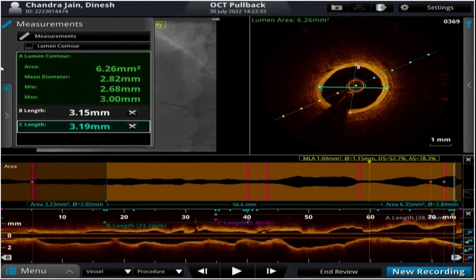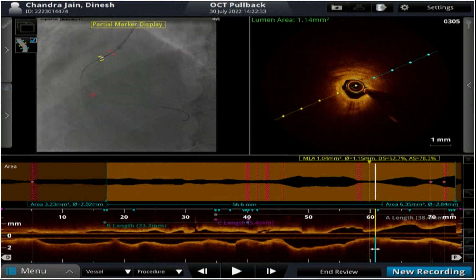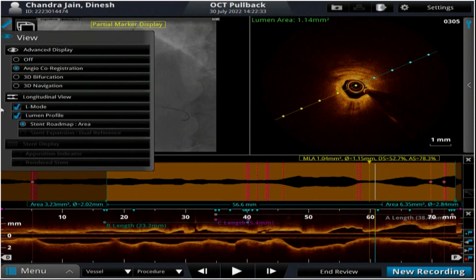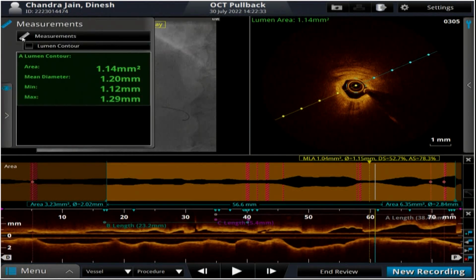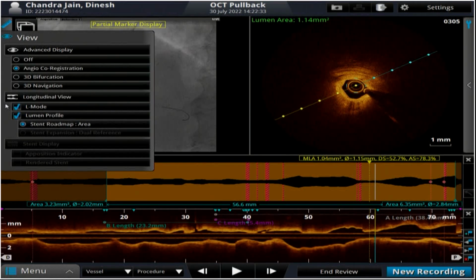The next thing to see is the nature of the lesion. Can we just see the morphology in the 2 places that we've identified? Ajay, I think you've shown us very good images over here with the saline and excellent co-registration. So we are happy with that injection of yours. You can give us the length and the diameter that you're thinking of.